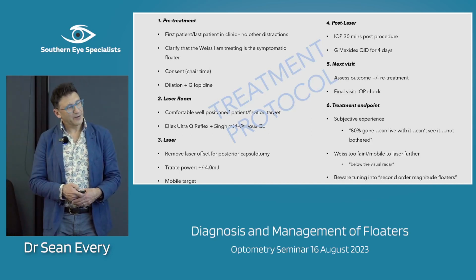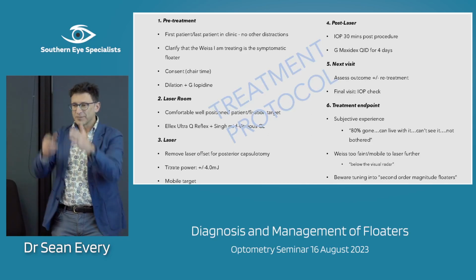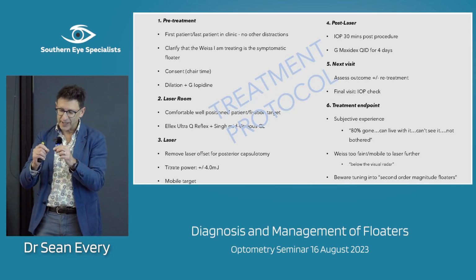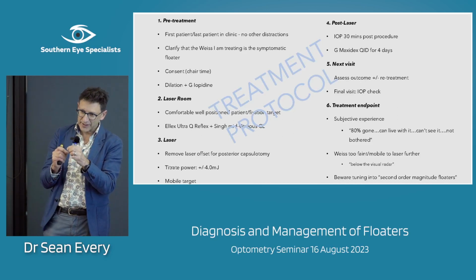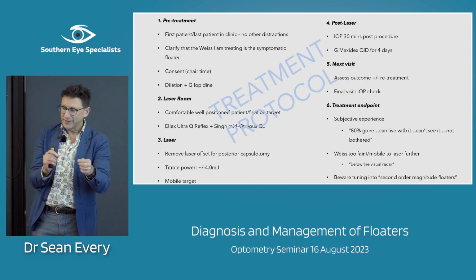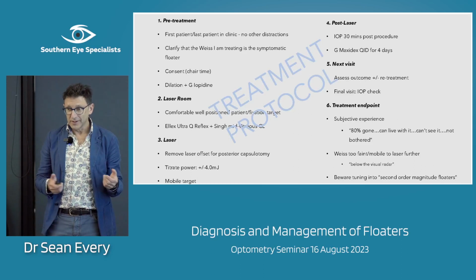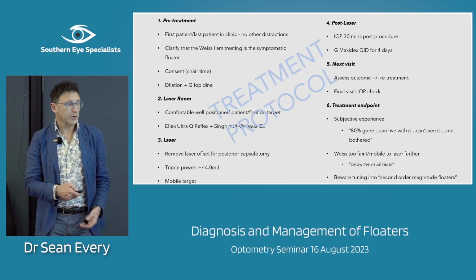The other important thing is that when we do a YAG posterior capsulotomy, you can just imagine the front of the eye, back of the eye, the lens is there, and you've got the posterior capsule behind it. You've got a fixation light, and then you've got where the energy happens, and we always do it so that the energy is offset posterior to the fixation light, so that if you haven't quite got it right, you're not pitting the lens. The photodisruptive event is happening more posterior. It's always set on that 200 microns posterior offset, but here I just remove the offset.